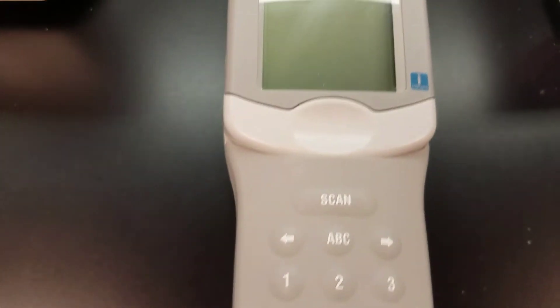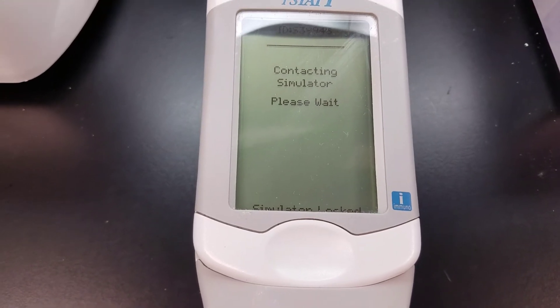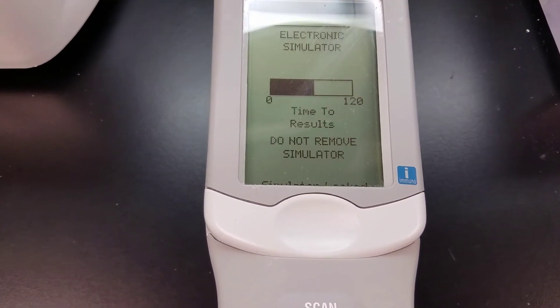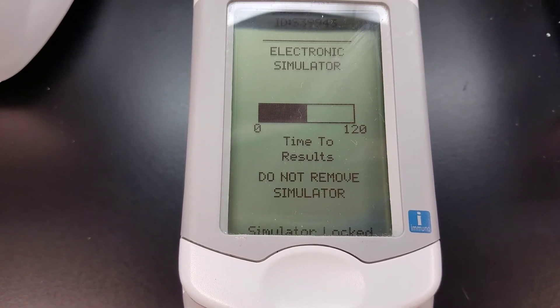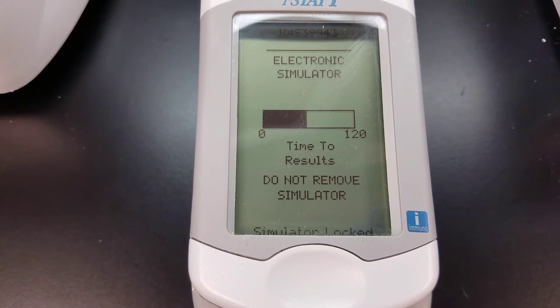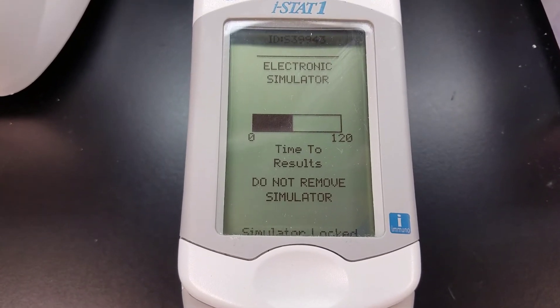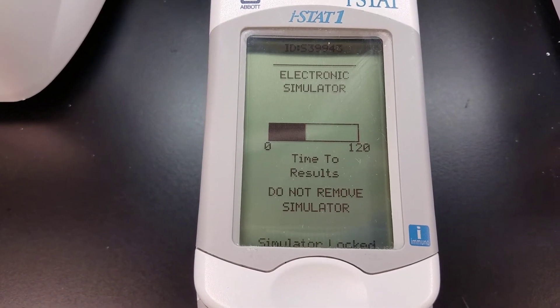Basically it's checking the electrical impulses, making sure everything's working correctly. Just like it would with an iStat cartridge, it's going to count down until the results are done, but it says 'electronic simulator' instead of, say, a troponin or whatever test you could be running.